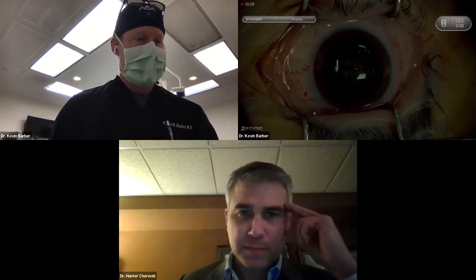Good morning everyone, or afternoon or evening depending on where you are in the world — welcome to my operating room. The goal for today is to go through two live surgical cases using advanced technology intraocular lenses, or premium lenses. The focus is for those just trying to incorporate ATIOLs — maybe early in your career or considering adding them to your practice. It's not a deep dive into all the finer details.